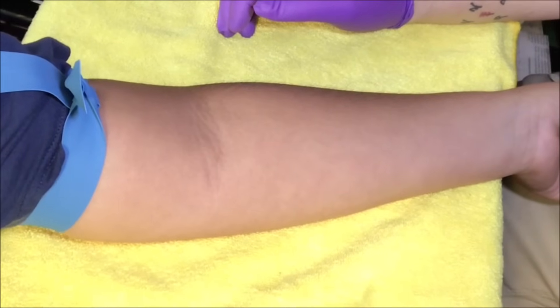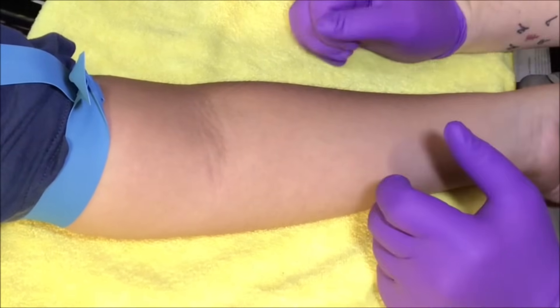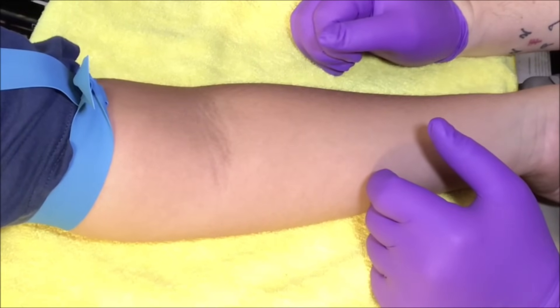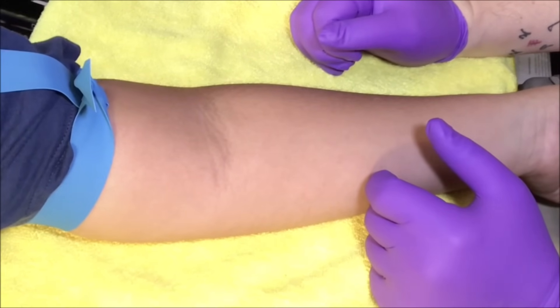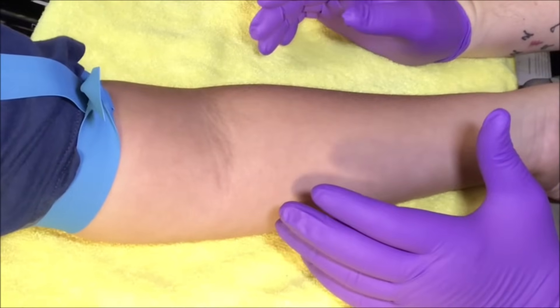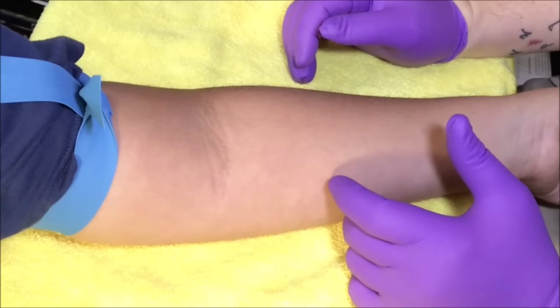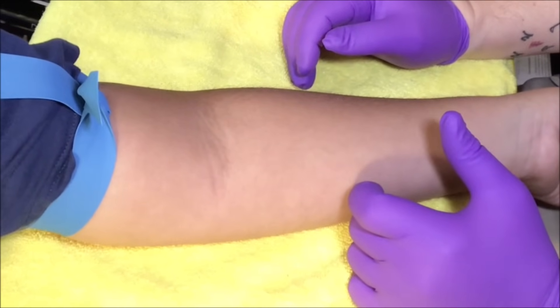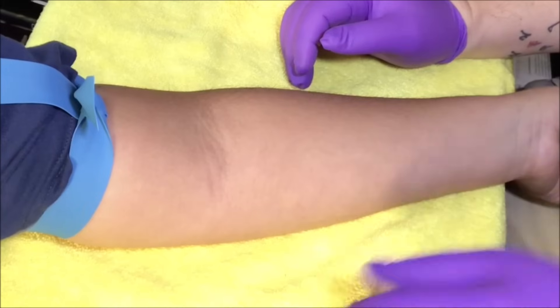Welcome back to Phlebotomy Solutions. Today I'm going to be showing you some basic techniques on locating difficult veins. Some people will have problems locating veins with arms that maybe are larger, somebody who's maybe obese, or veins that are a lot deeper. I'm going to show you some basic techniques that might help you to be able to locate a vein.